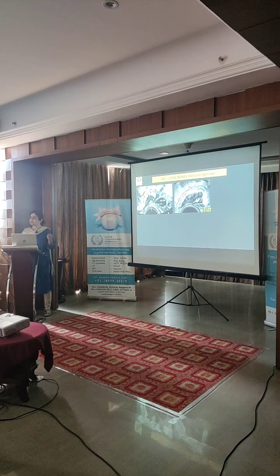So remember, I very often, as I do a lot of training, have people who send me images saying, Madam, is this DIE? It's just something dark in the pouch of Douglas. Anything dark in the pouch of Douglas is not DIE. You need to be able to see the signature of the bowel. You need to be able to see the layers, and then one part of the anterior muscularis, or whichever area it is, should be a large solid tissue with poor vascularity, very often tender.